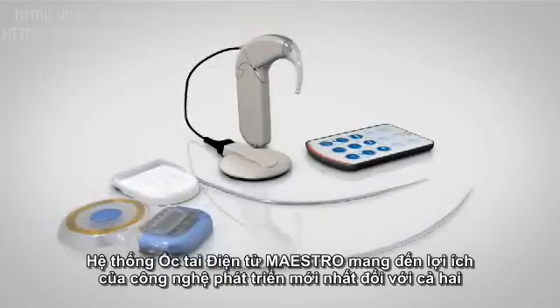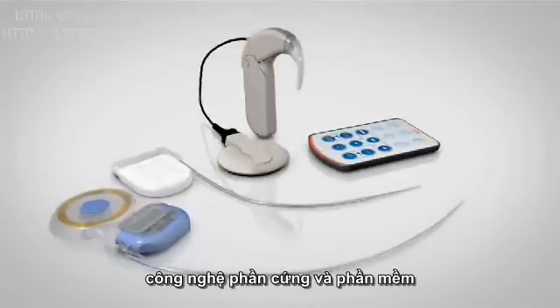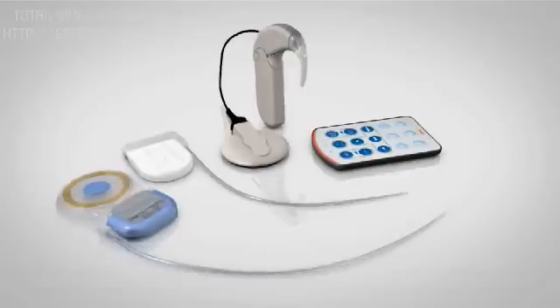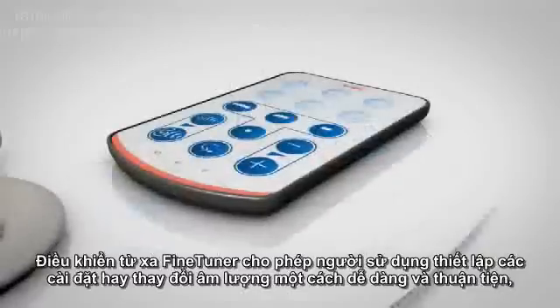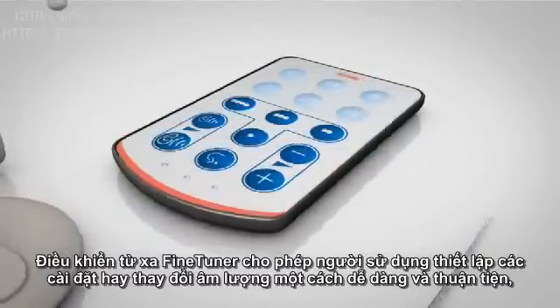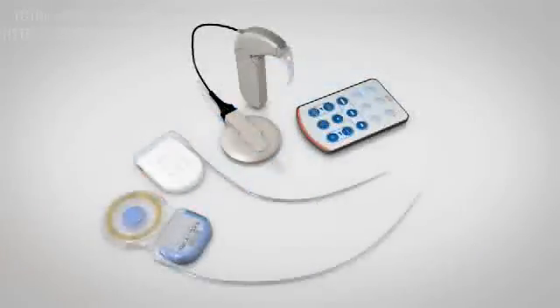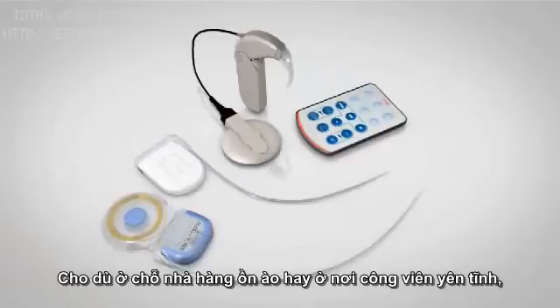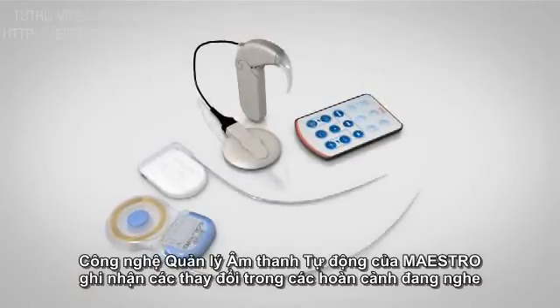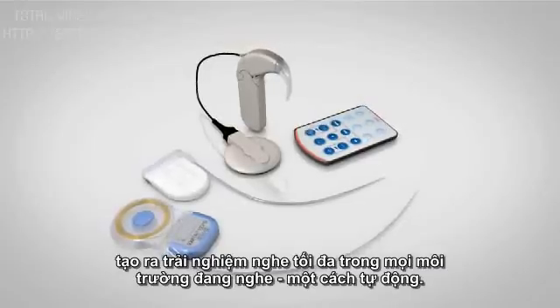The Maestro Cochlear Implant System takes advantage of the newest developments in both hard and software technology and is designed to be easy to use for both children and adults. The fine-tuner remote control unit allows users to make setting or volume changes easily and comfortably without the need to remove the processor from the ear. Whether in a noisy restaurant or a quiet park, Maestro's automatic sound management technology adapts to changing listening situations for an optimal hearing experience in every listening environment automatically.